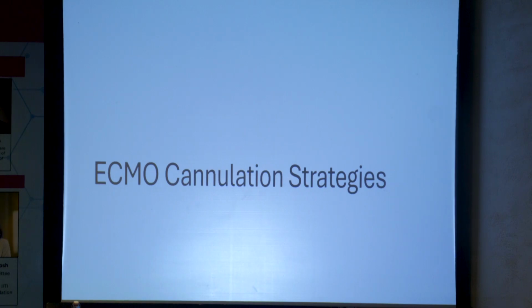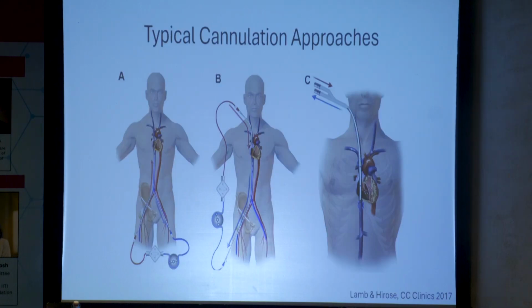In terms of you've made the decision to put your patient on ECMO, how are you going to do it? What are the different physical, technical strategies you can use? That's not a simple question, and there are multiple strategies. The most common ones are shown on this slide, where you have on the left 2 cannulas in a femoral vein, one on each side.